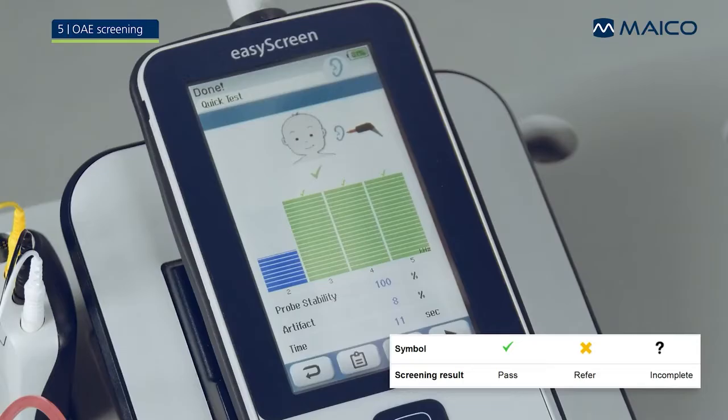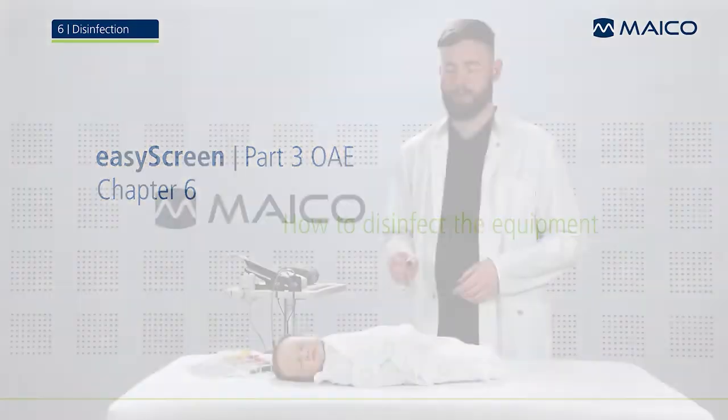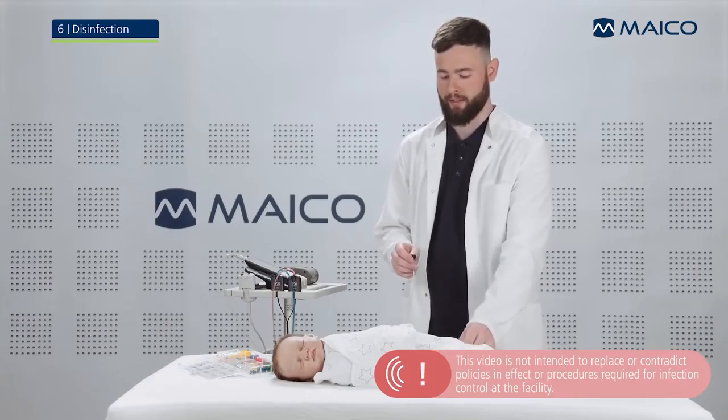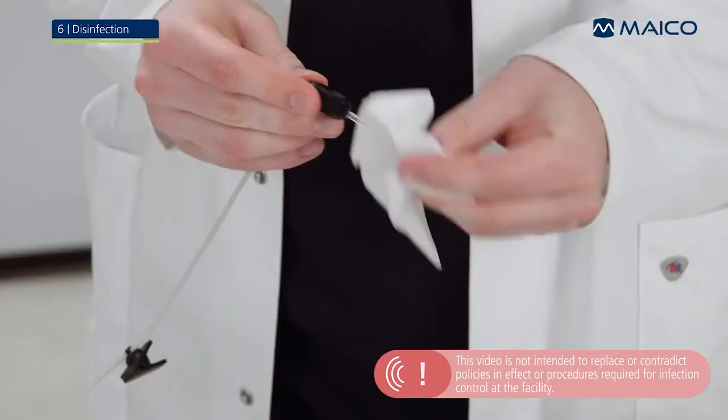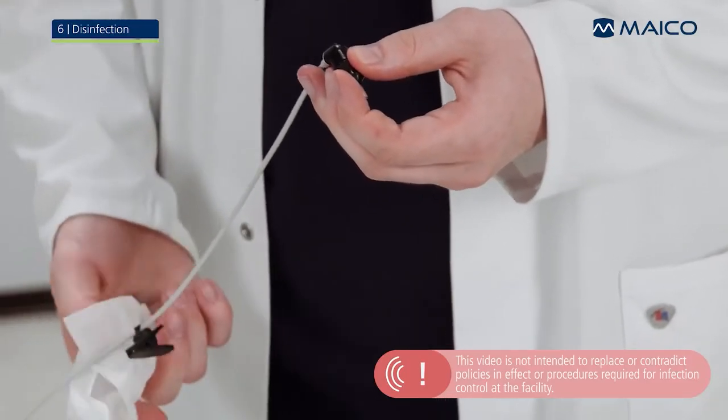Remove the probe and measure the other ear. After both ears are screened, remove the ear tip from the probe and discard it. Clean all components with a disinfectant wipe. It is recommended to use cleansing wipes without alcohol.